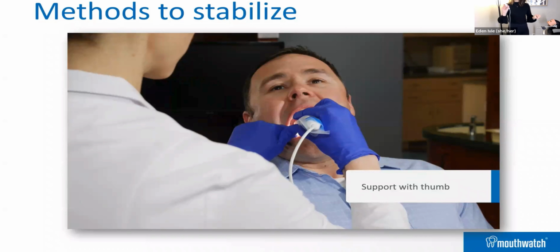Okay. When I teach this class in person, we do a hands-on section, and I go through all of these stabilization techniques. People attend my class, and they come into practice with the camera in one hand, and they come in like this. This is natural. This is what we think we should do. You are not going to be able to get a clear image because the second you push that button, your hand is going to move. So you really need that stabilization so that you can push that button without moving your camera.